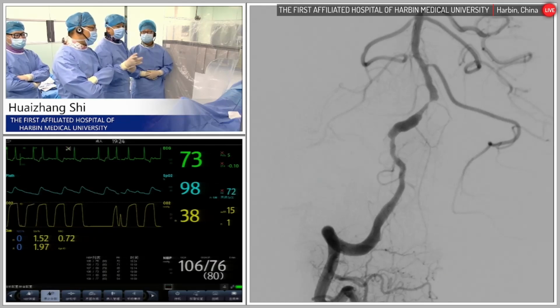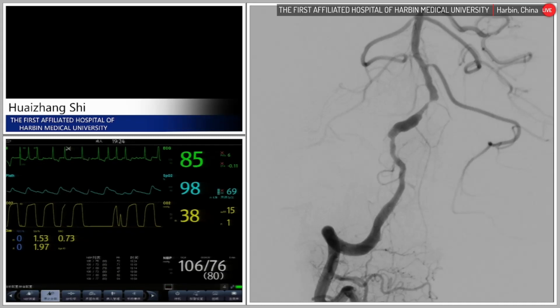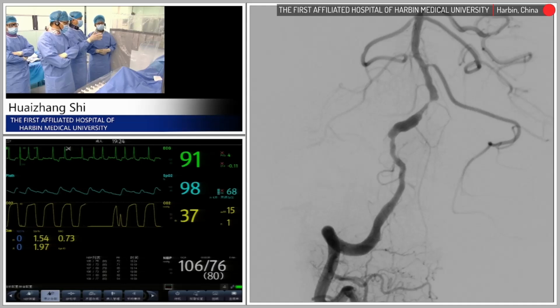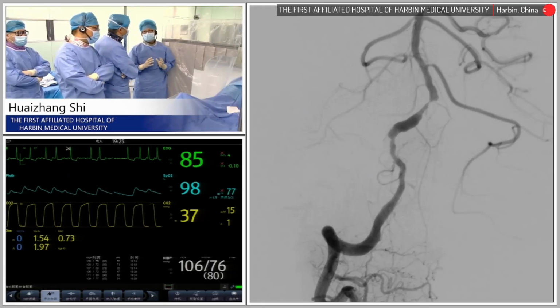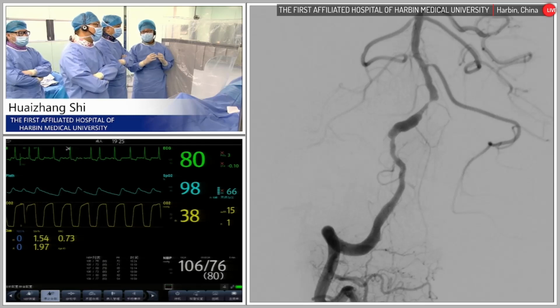So we take the high resolution MRI. I see. From the HR MRI, we can see the blood vessel wall clearly, and we can see the plaque here, and we know it's atherosclerotic stenosis, so we treat it. I see. So the use of high resolution MRI is very important to confirm the etiology of this stenosis. So right now we are sure this is caused by atherosclerosis, not dysplasia, for the right side.